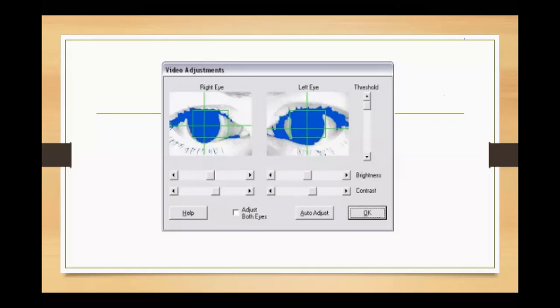Then there is muscle artifact. Why? Because the eye keeps blinking, right? If the eye keeps blinking, then it is also a muscle potential, and it will also be recorded.